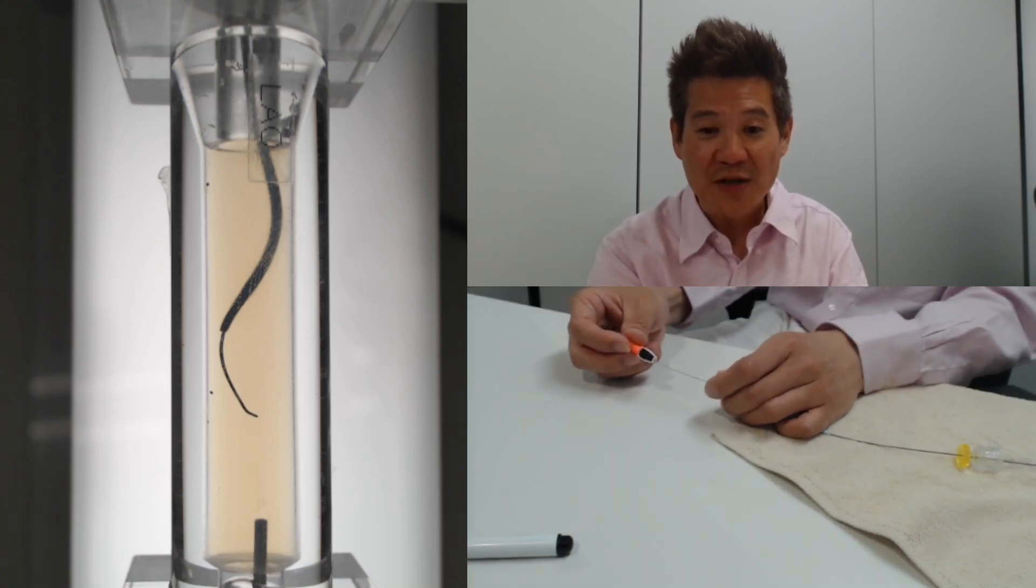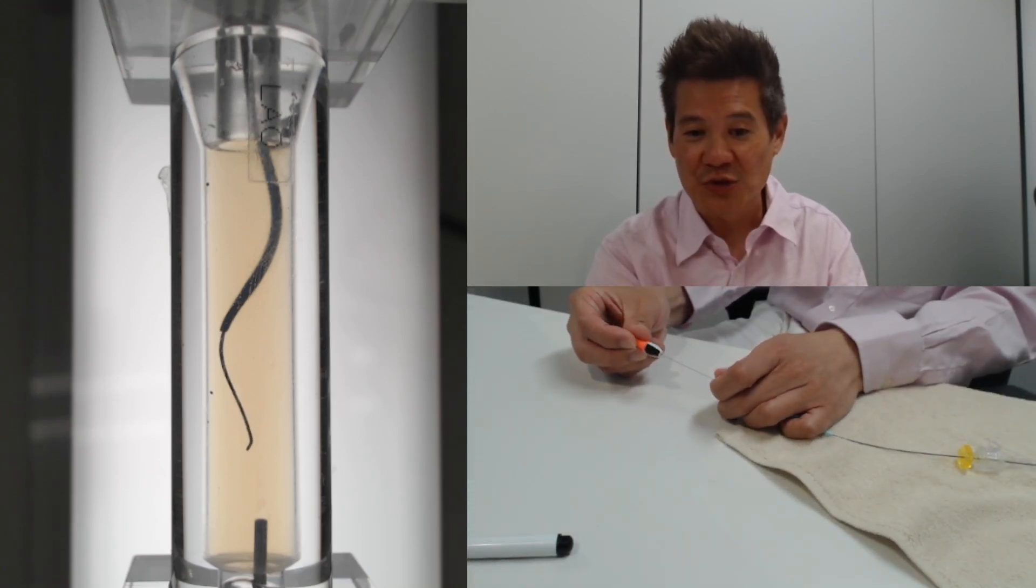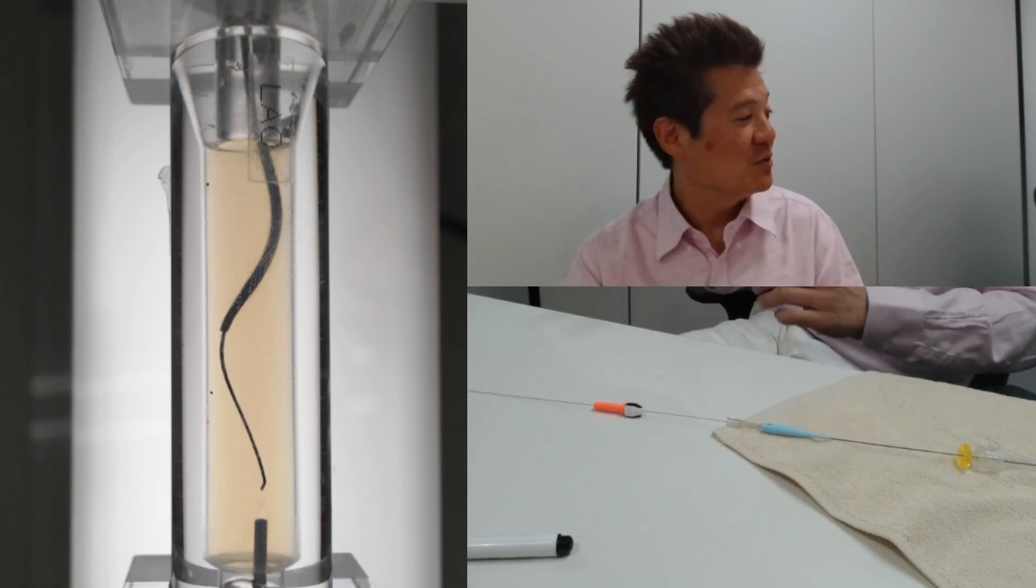If the wire is quite near the distal cap already, we just do what we usually do which is turn the wire in one view, getting near the cap. When we get near, we check the other view.